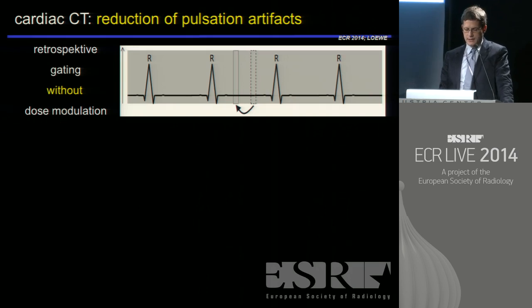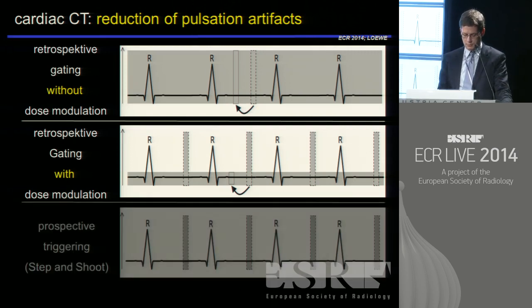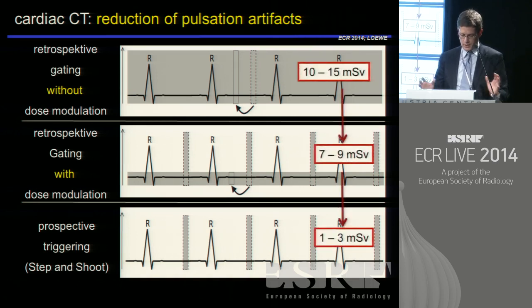Right now, cardiac CT becomes a little bit more complex. We can choose from different scanning modalities and scan modes. The selection of one of these modes mainly depends on the heart rate of the patient, so we should individualize our scanning protocol. It makes a very big difference to the patient which mode we choose, since the dose range for the radiation exposure is between 1 millisievert and up to 15 millisievert.